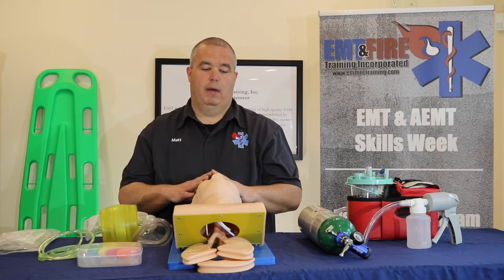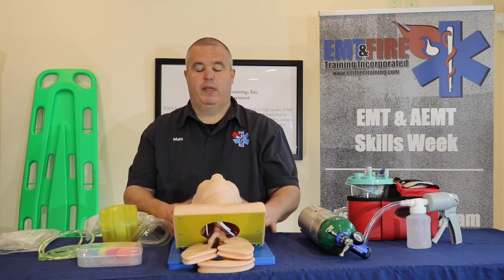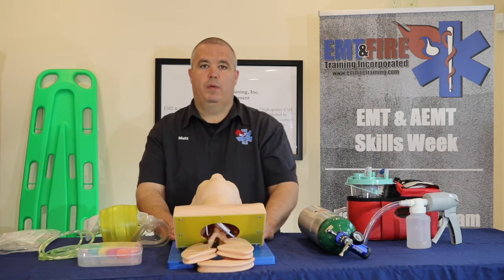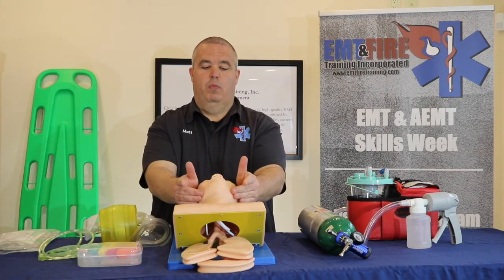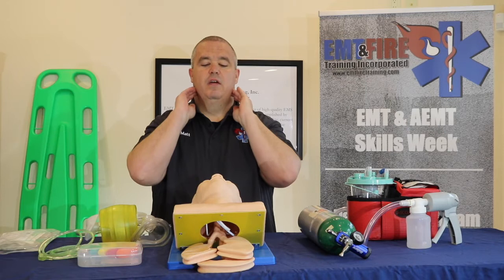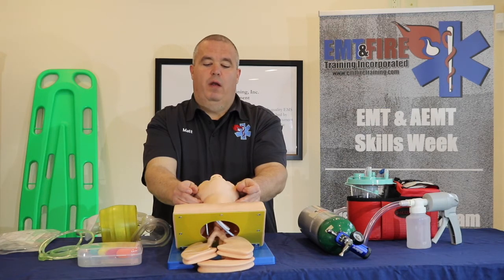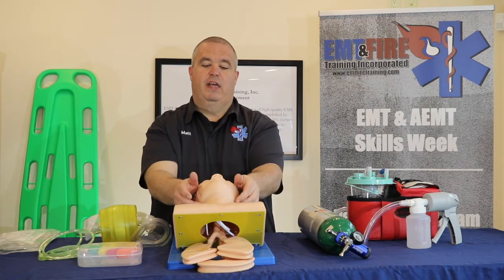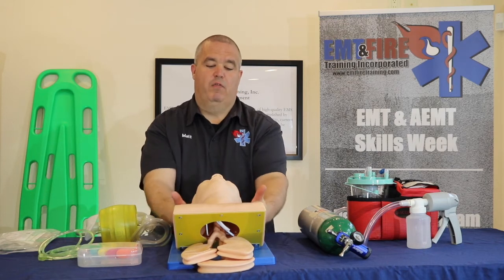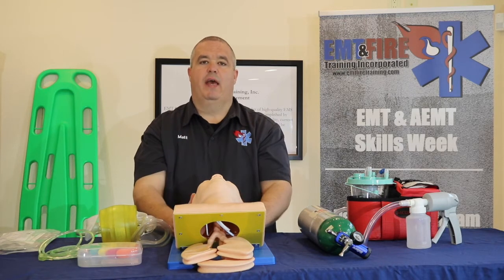We need to do a few more things before we can ventilate. First, we need to open his airway. There are two ways to open an airway. The first is called a jaw thrust, where you bring your fingers underneath their jaw and raise it toward the ceiling to pull the tongue off the back of the throat. Your partner then ventilates the patient — that takes two people. We do the jaw thrust if we suspect any cervical spine trauma and don't want to crank the head back.